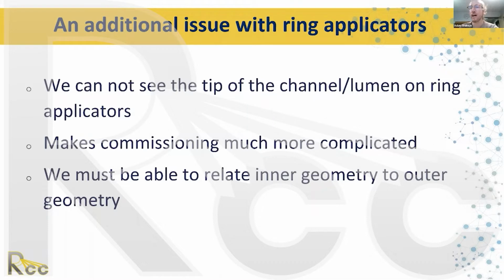If you've got model files in your TPS, you can look at the outer geometry versus inner geometry, or you can just go by the manuals provided by the vendor and look at measurements from the outer geometry and how that correlates to where the source should be on the inside. Again, more details and pictures to come.